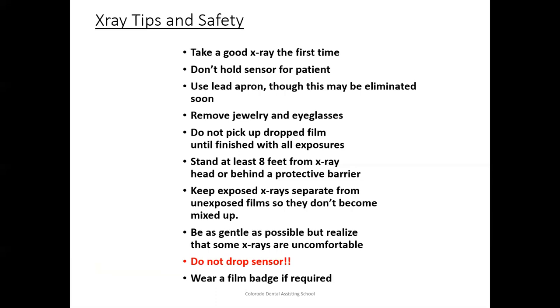So talk to them and let them know, okay, I'm going to put this in there real quick. I know you're in pain today, but we need to get an x-ray of this tooth. I'm going to run out there, push the button, and as soon as it's done beeping, you can take it out of your mouth. You don't have to wait for me to come back in the room. Whatever you need to tell them to make them more comfortable, please be sympathetic with your patients because x-rays aren't very much fun. And just let them know, we will be done really soon. It won't take that long. I just need you to cooperate with me.